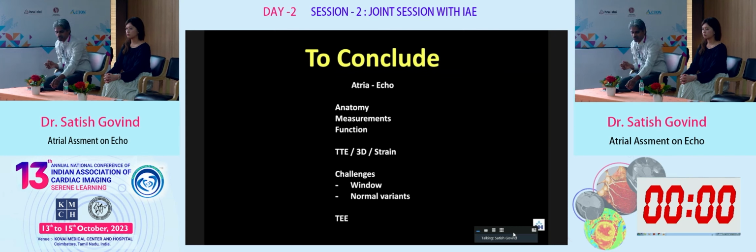My final slide is when we look at atria in terms of echo, and obviously from the imaging side also. It is going to be looking at anatomy, measurements, and function. From the echo side, we look at TTE as the first line, and we use 3D to some extent. Strain is still early days, but LA has a lot of data coming in, and 3D as far as TEE is concerned has its uses.